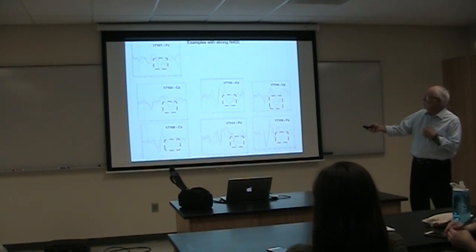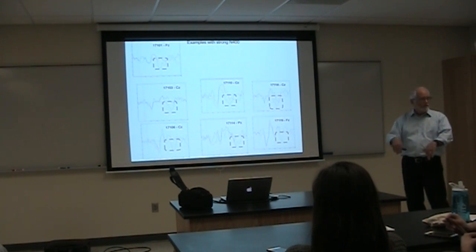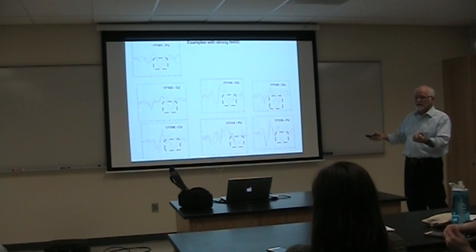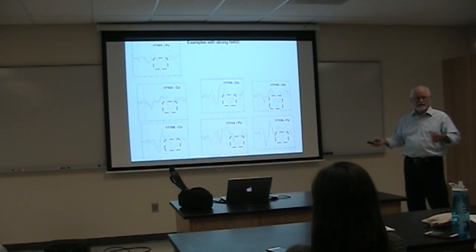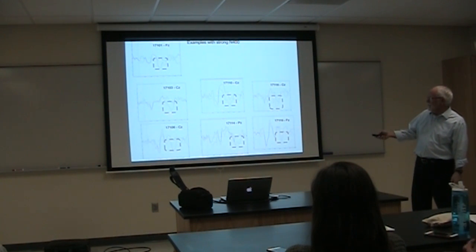Can you see this one? This is participant 17101, and you can see at 400 milliseconds, you can't read that, but I can read 100, 200, 300, 400. What we're seeing is a pretty strong pink line deflecting below the black line. So this person's brain was reacting very differently to the nonsense sentences than to the others. Here's 103, another good N400. 106, another good N400.